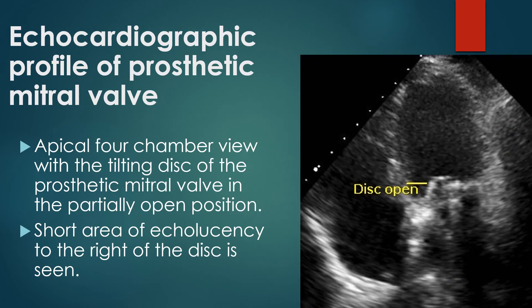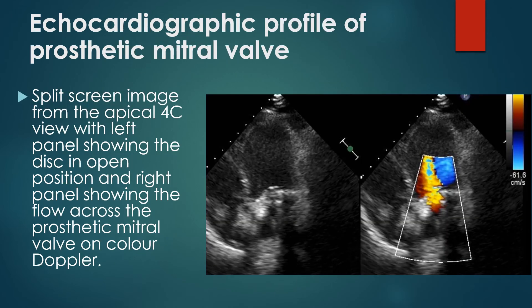The apical 4-chamber image shows the tilting disc of the prosthetic mitral valve in a partially open position, with a short area of echolucency to the right side of the disc. A split-screen image from the apical 4-chamber view shows the left panel with the disc in the open position and the right panel showing colour Doppler flow across the prosthetic mitral valve.